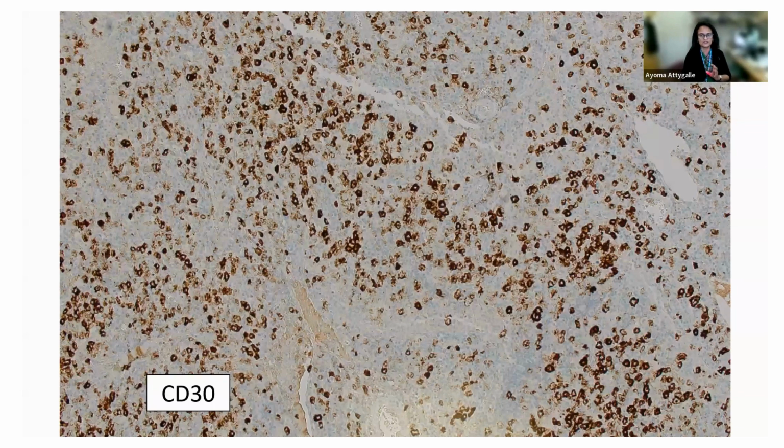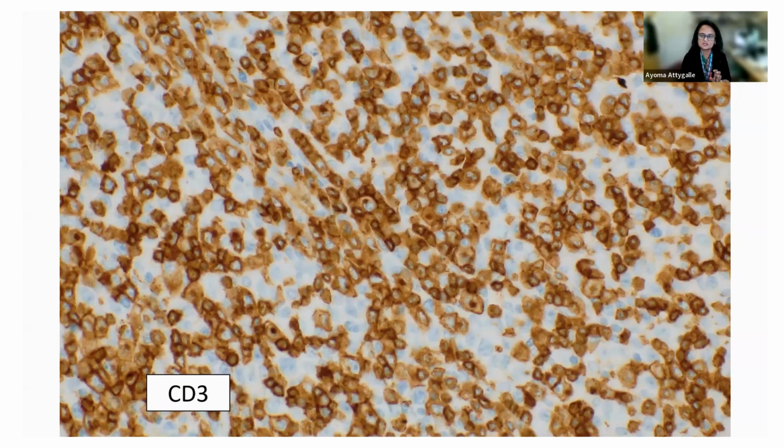And remember, don't ever forget that the age of the patient is 25 years. If you see T-cell lymphomas at this age, it would likely be anaplastic large cell lymphoma, which has large anaplastic-looking cells. Those are often ALK-positive anaplastic large cell lymphoma at that age. So this doesn't look anything like it. So there's a spectrum of changes in the T cells as well. You have a few large cells, but most are medium and small.